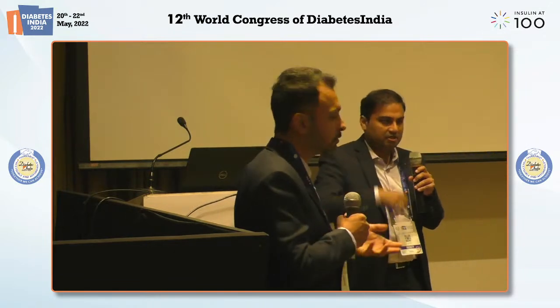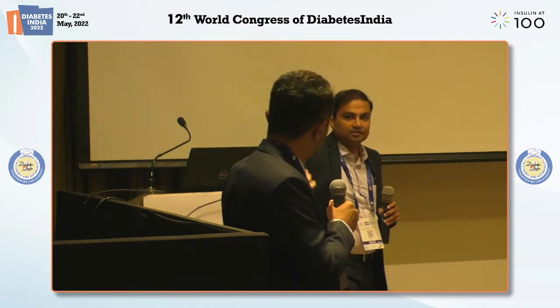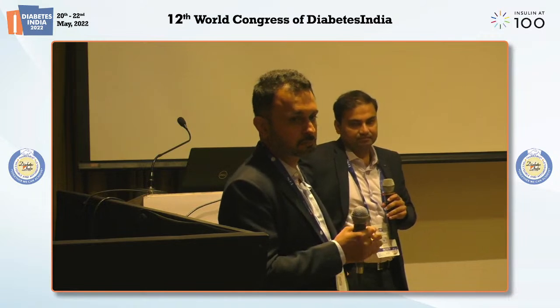So we'll keep a window period. That's the intent. If you're doing two CGMs, you can keep one CGM at 12 to 14 weeks. If you're doing the initiation, the problem which I feel, and that's what we were also discussing, is there's going to be a lot of variation. But that's also something that you can pick up. Initially, you can put the CGM, and then you can do another somewhere between 18 to 24 weeks. This is the TIR to start with, and this is the difference that you have got. Your primary endpoint is to see the change, the effectiveness, in TIR. Absolutely.